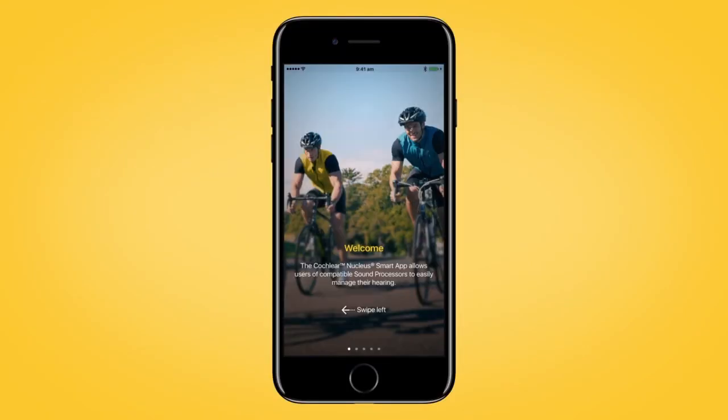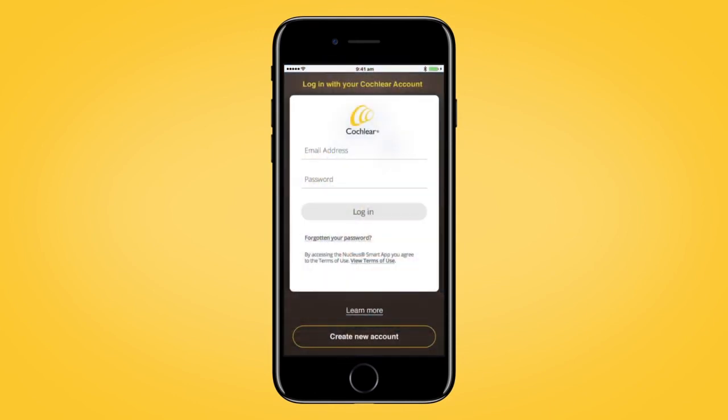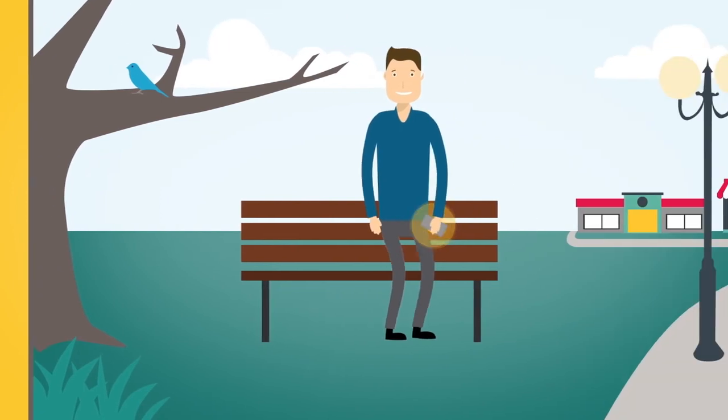Once downloaded, open the app and log in using your Cochlear account details. When you have signed in, your processor will automatically be recognised by the app.